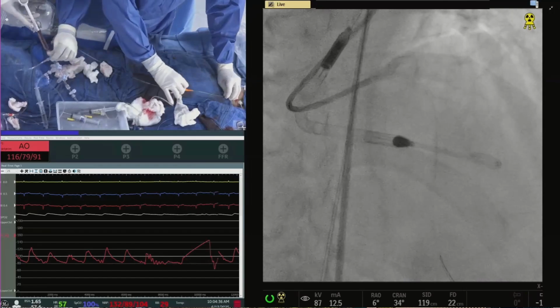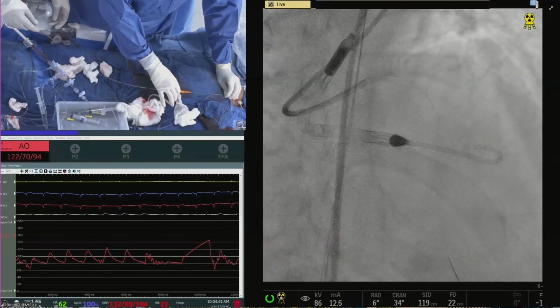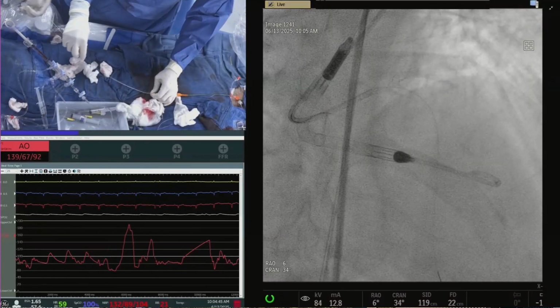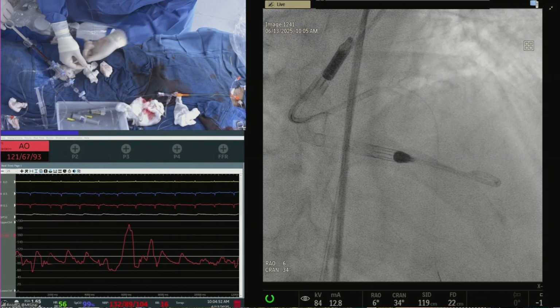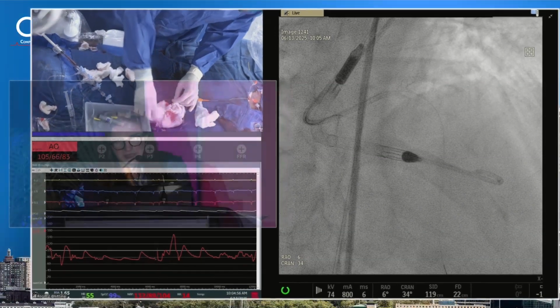Okay, let's at least image the LAD. You guys have 4 minutes, and I'll go see the other case and what's happening in the other room. So maybe, what should we do? Can I go to the other room, or are you going to cross that diag again? You want to see the LAD imaging? I do, yes, please. So then we can make a decision.